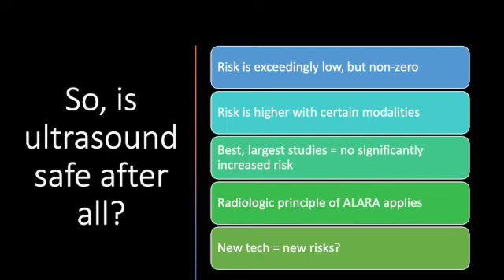So, a quick summary slide here. Is ultrasound safe after all? Yeah, it is. The risk is exceedingly low, but it is non-zero, and so it's important that we be honest about that with our patients when we're counseling them.